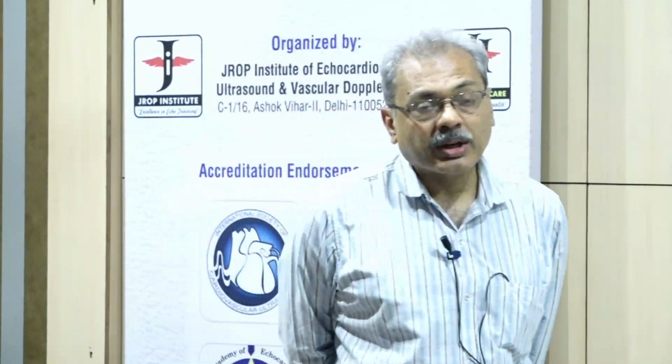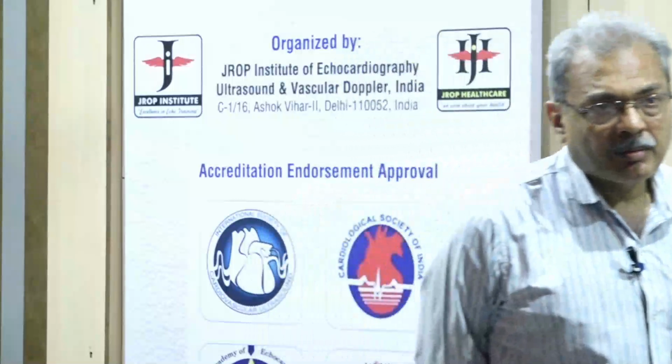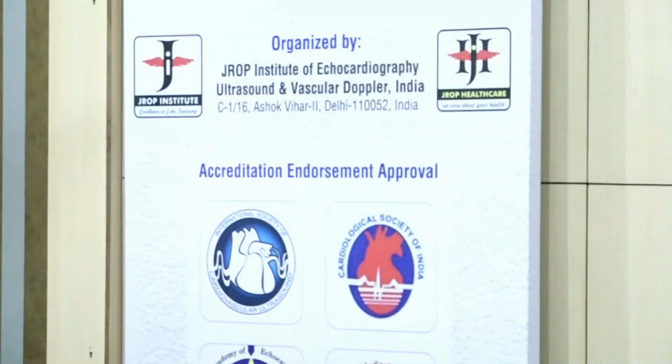The mitral rim is actually not seen. Sorry? Mitral valve rim? While the device is implanted, there is sufficient margin for the mitral valve to close. It does not interfere with its closure. No. Mitral valve, you are pretty much safe all the time. Tricuspid, you are pretty much safe all the time. No need. The IVC margin is quite clear. No? If your IVC margin is 5 millimeters, 7 millimeters away, you are pretty much safe.